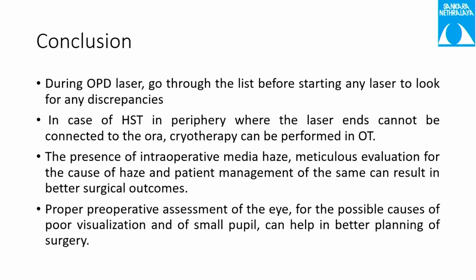And to conclude, during OPD lasers, go through the laser list before starting any laser to look for any major discrepancies between your findings and the previous day's findings or the previous consultant's findings. In case of any HST or any break that needs urgent treatment, where laser ends could not be connected to the ora, one might do cryotherapy to the laser edges to connect them to the ora serrata, which can be done under OT under general anesthesia or local anesthesia wherever required.